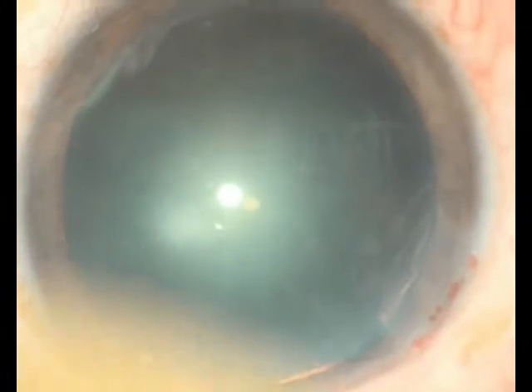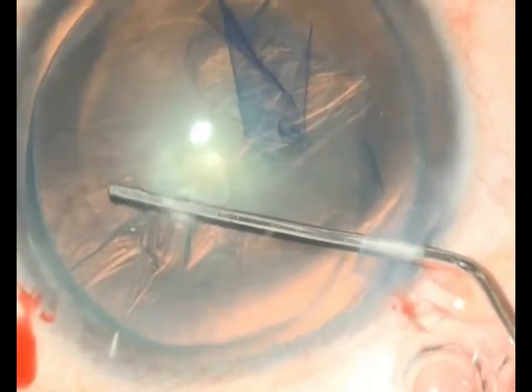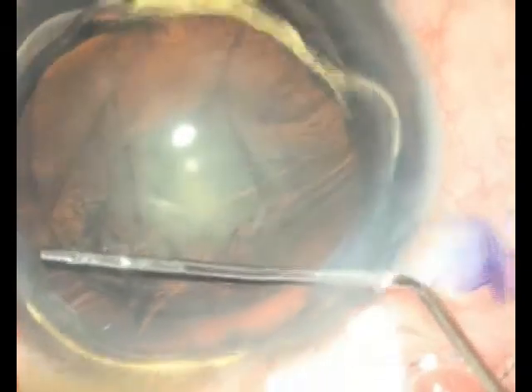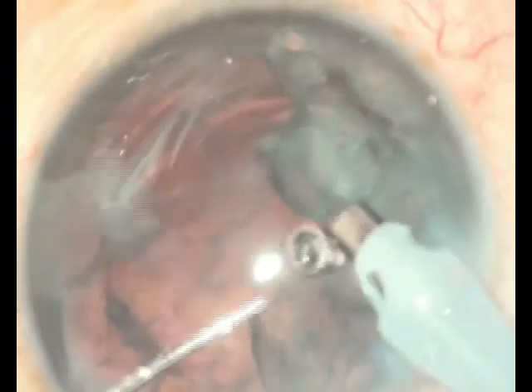I believe that the safest, simplest, and most optimal technique of managing a very soft cataract is what's demonstrated here: a hydro prolapse of the endonucleus into the anterior chamber, followed by its aspiration and complete removal. This technique of hydro prolapse and aspiration will actually reduce the risk of posterior capsular rupture.